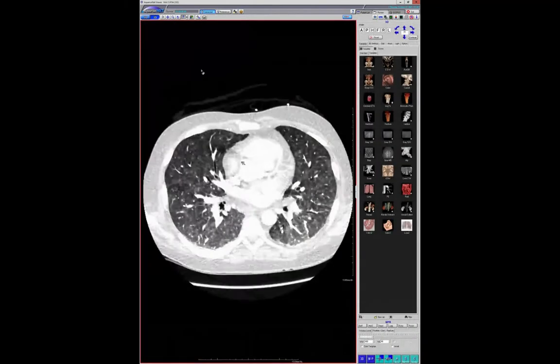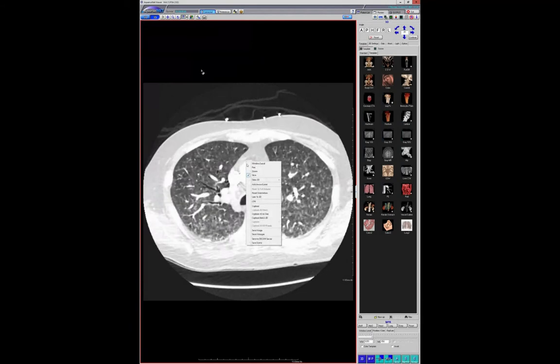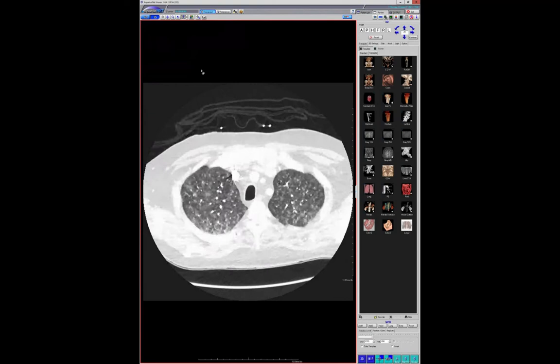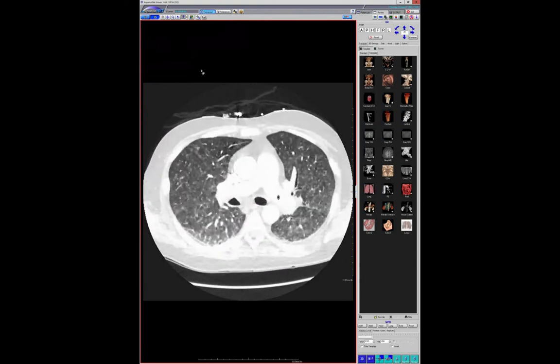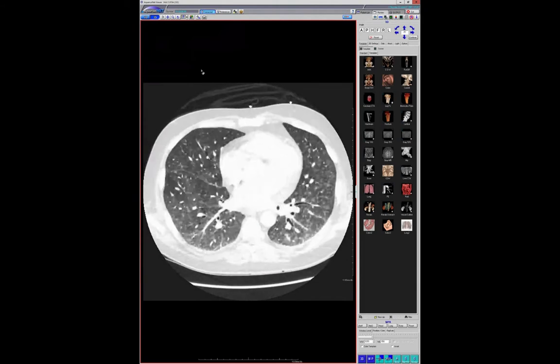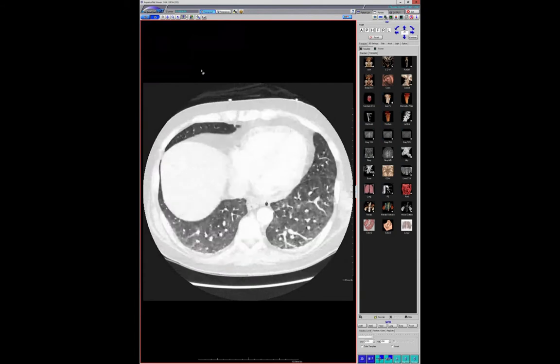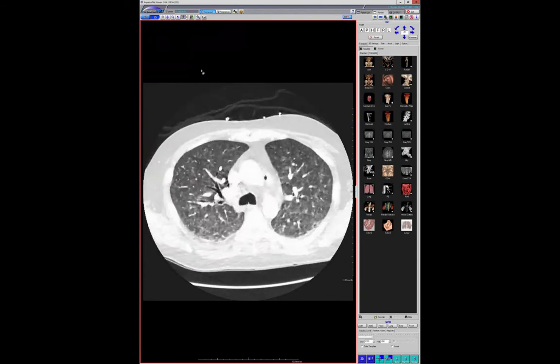And here's another interesting case someone showed me, and nothing I think many of us would get from the imaging per se. I've seen this two other times. And in those cases, it presented with something that's also quite difficult to get from imaging, but at least you may be able to suggest. This guy was quite immunocompromised, I can't remember why. He wasn't HIV. He might have been a stem cell transplant at some point.